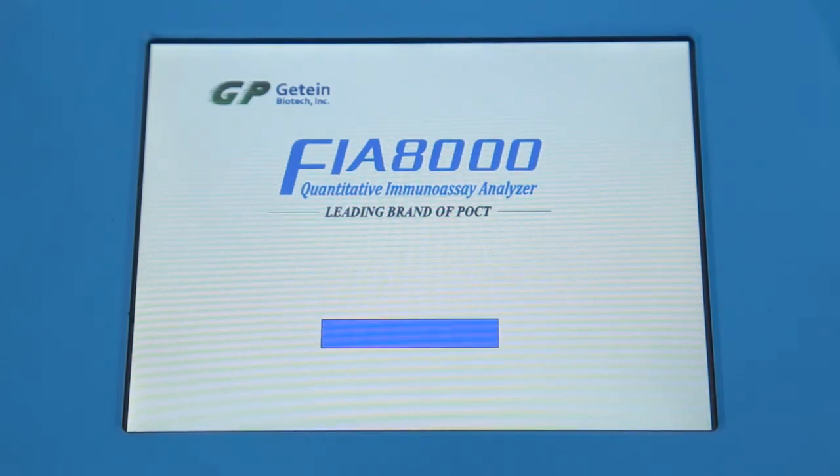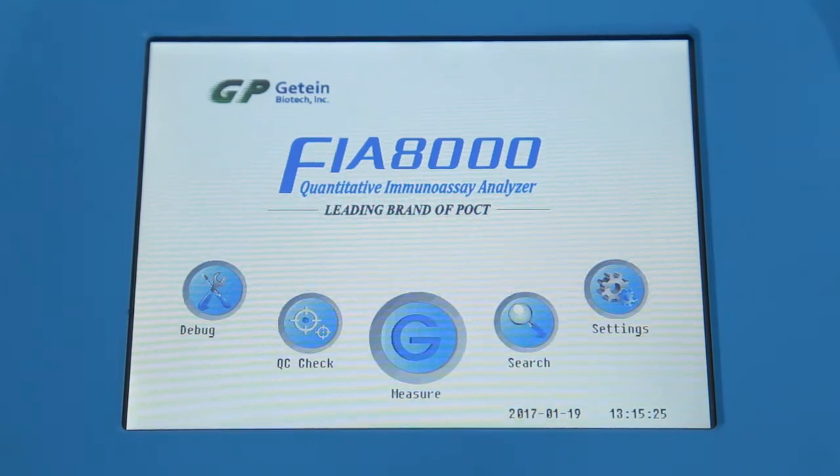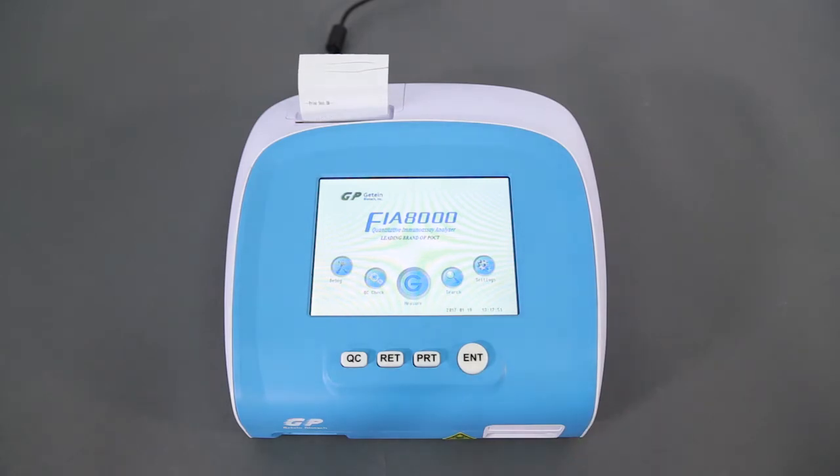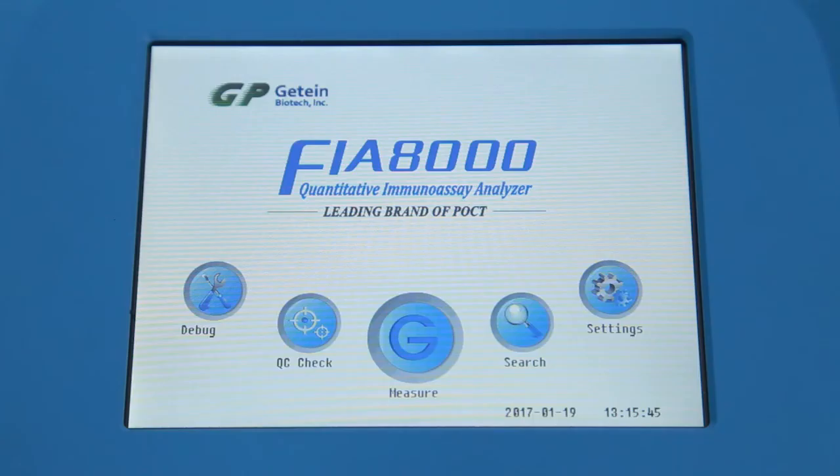After turning on, the analyzer will automatically start up the self-test program. The main interface will be shown on the screen after the completion of the self-test program. Press the PRT button to run the printing test. The icons on the color touch screen will lead you to navigate through the menu.